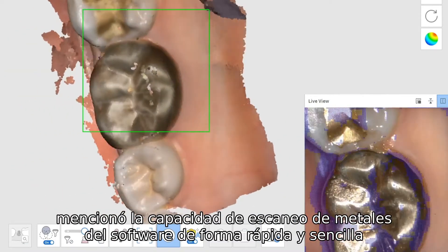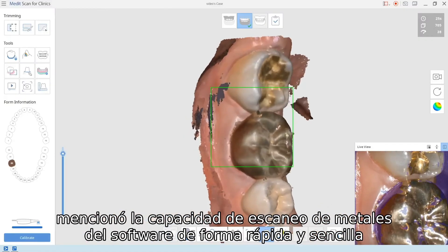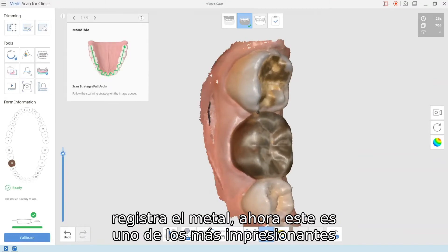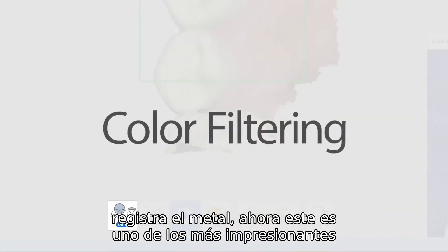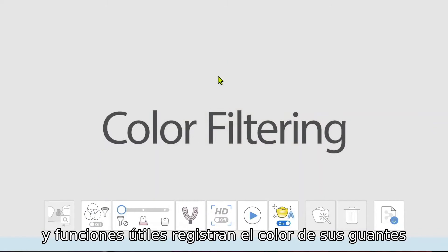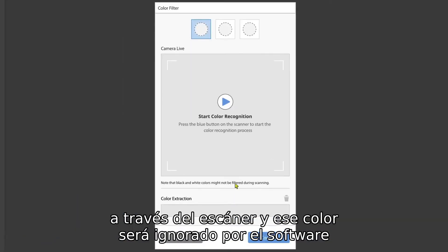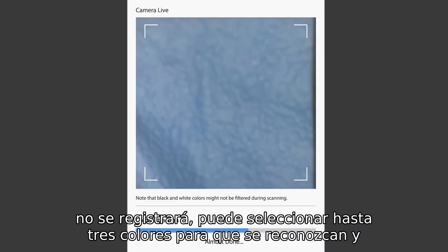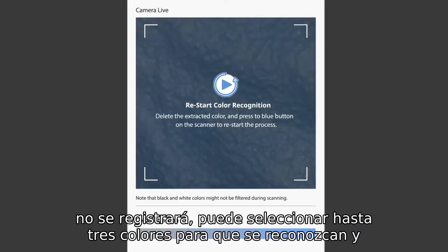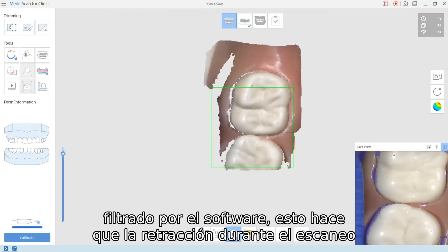The metal scanning ability is worth noting — the software quickly and easily registers the metal. Now this is one of the most impressive and useful features: register the color of your gloves through the scanner, and that color will be ignored by the software — it will not register. You can select up to three colors to be recognized and filtered.